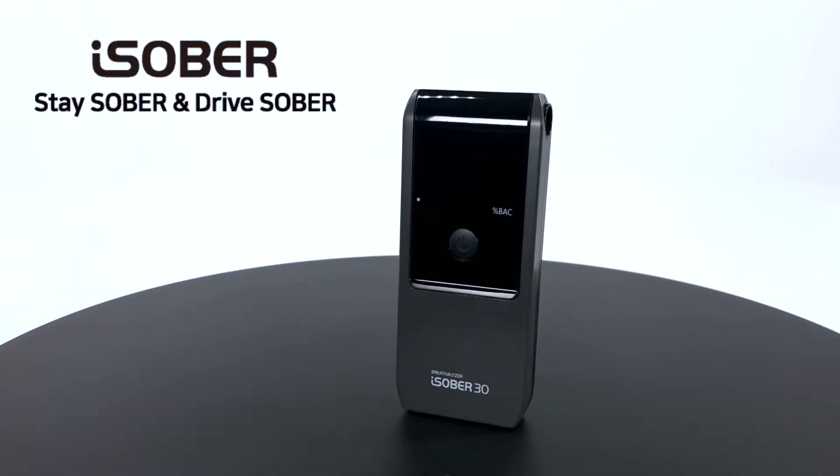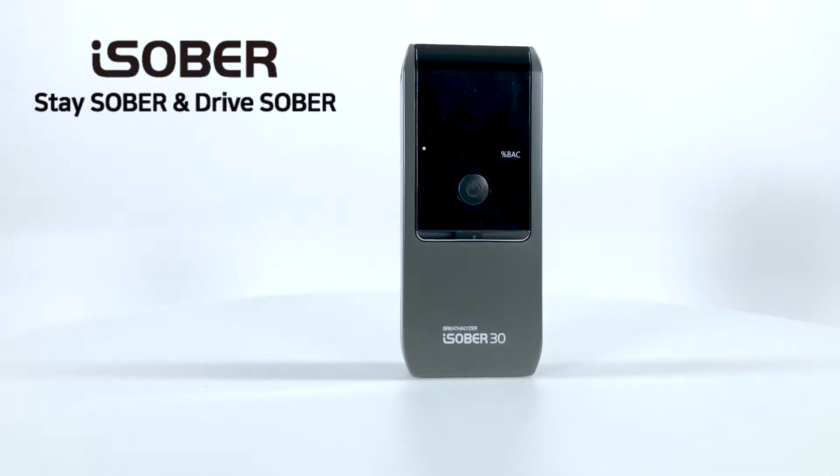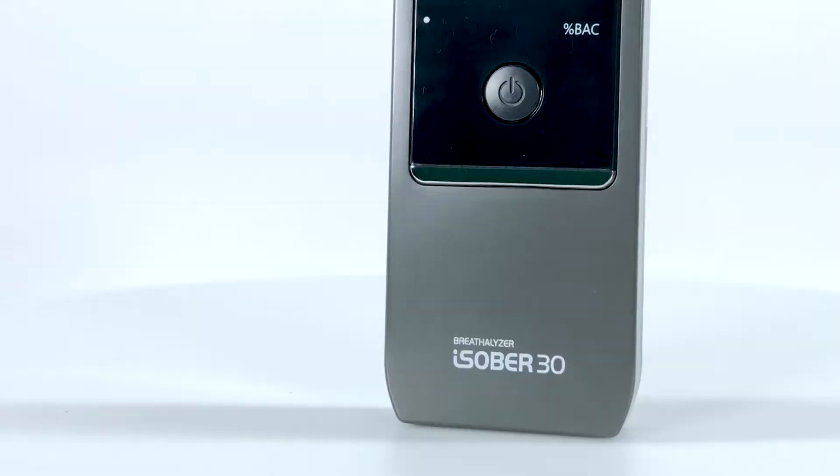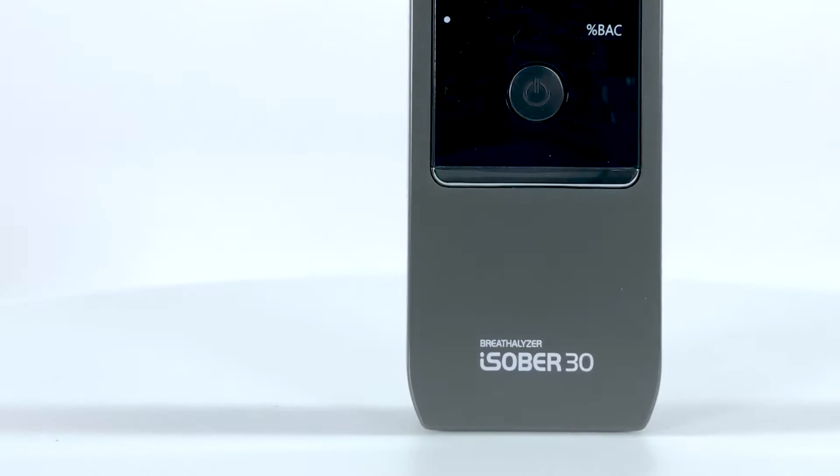Welcome to the Centex Portable Personal Breathalyzer, the iSober 30, that accurately measures your BAC or blood alcohol content, purely for reference.